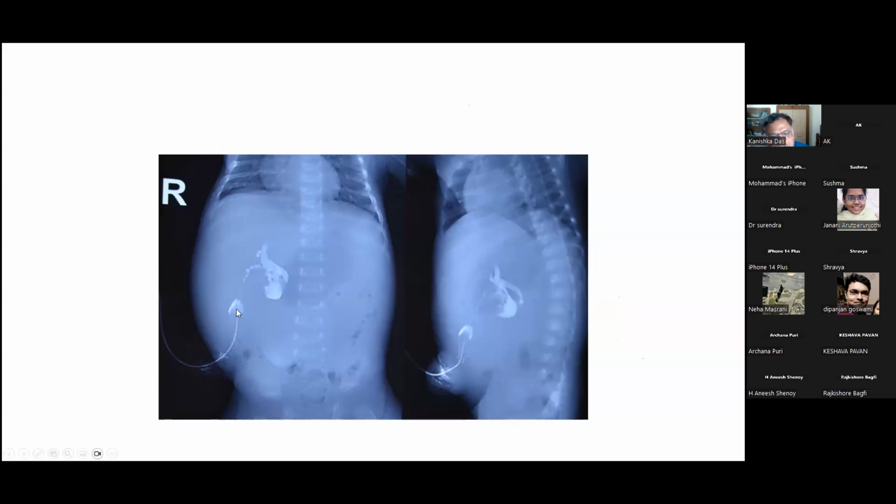So are you telling me this is a percutaneous cholangiogram? Identify the places. Appearing to go through the umbilicus, sir. Okay, let me tell you. This is the gallbladder. Yes, sir. And this is the Foley's bulb. So we have put a Foley. This is a cholecystogram. Initially, we went in and just did a cholecystostomy for the spontaneous biliary perforation. Two weeks later, or 10 days later, we have done this cholecystogram. Now you read the cholecystogram.